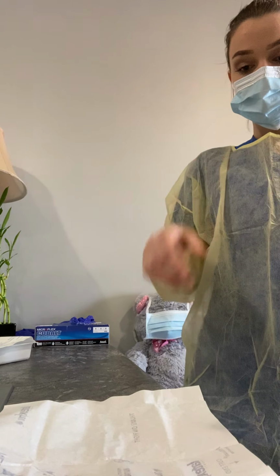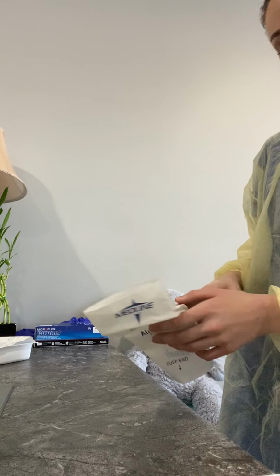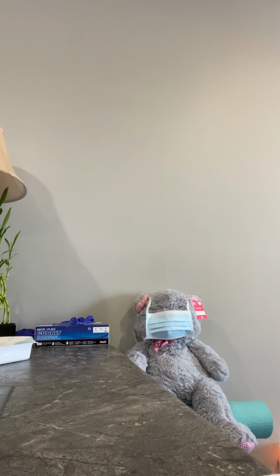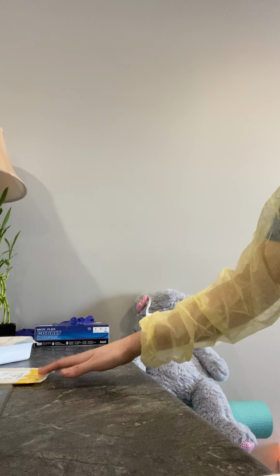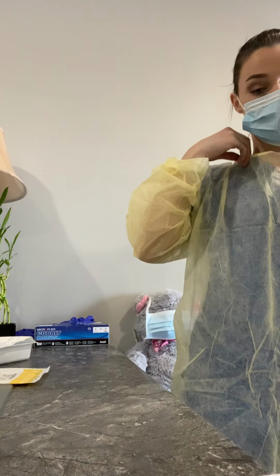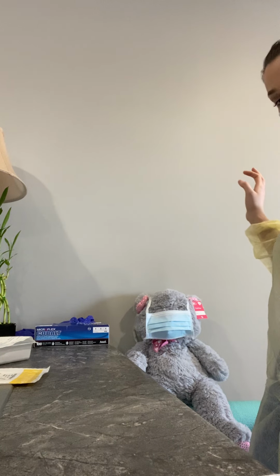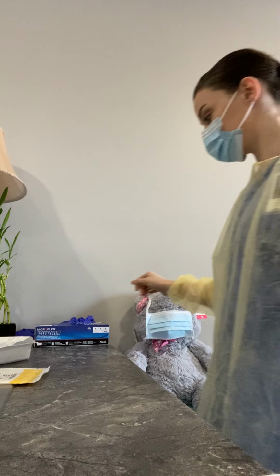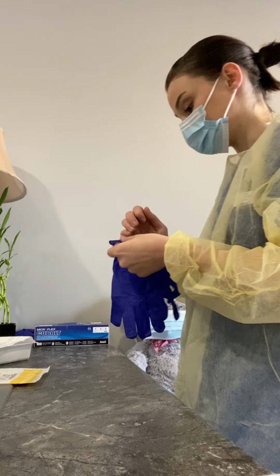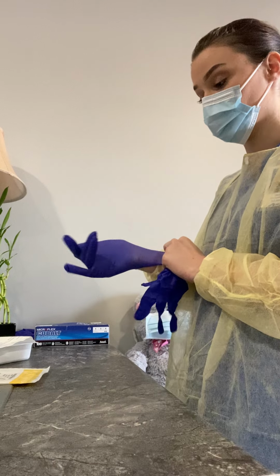Okay. So for the second one, I have to have my gown on as well. And I'm going to access her port. So I'm first, again, going to tell my patient to put her mask on. I'm going to have my mask on. I'm going to put on my clean gloves. Let her know what I'm doing, like you've got to get some medication today or your chemo treatment. Whatever she's getting, I'm just going to let her know why we're doing this.